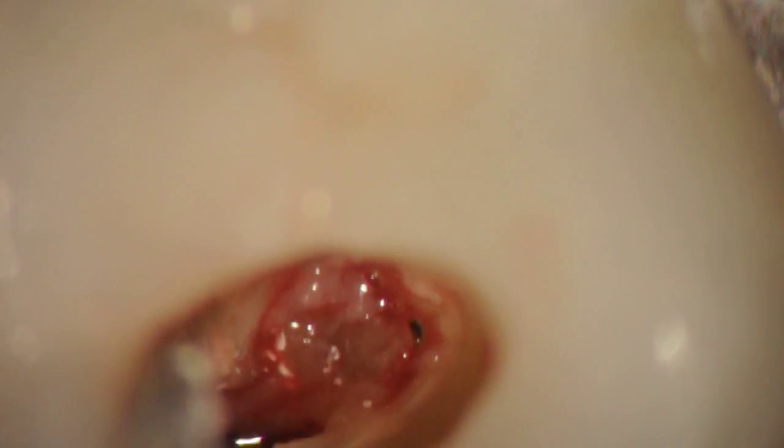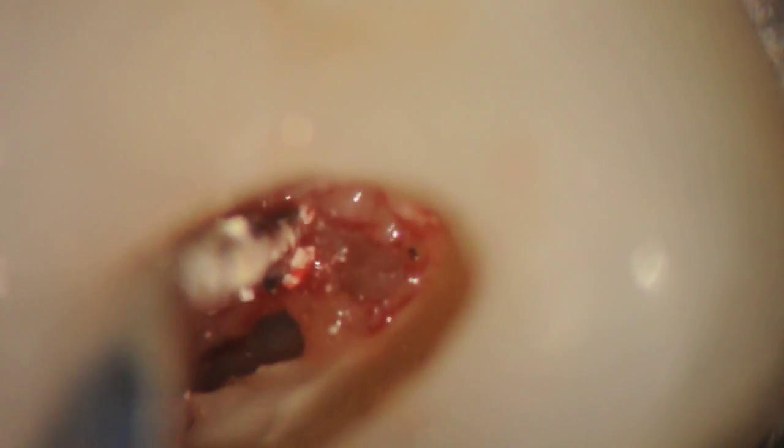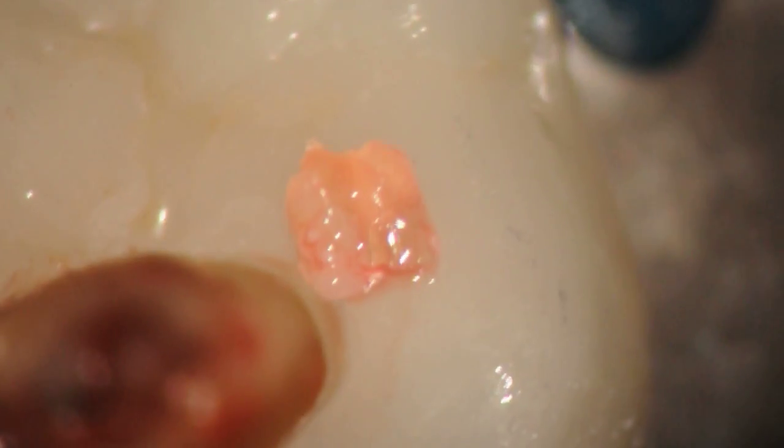There's still pulp stone right here — watch this. Clear. It has a clear color to it, you can see there. You can grab that. Now you can see how much more you can view the floor.